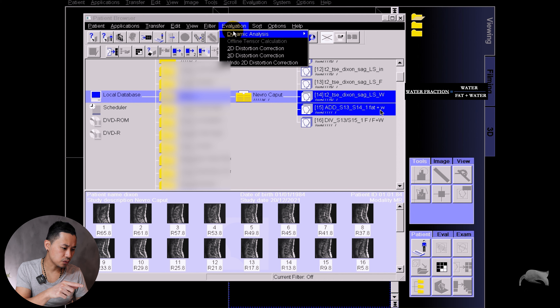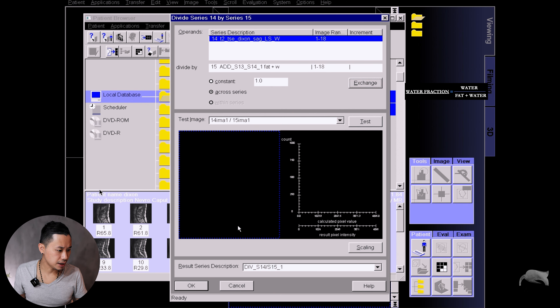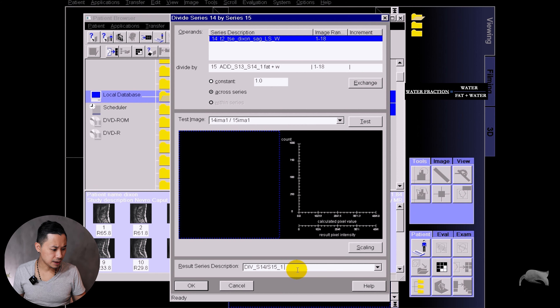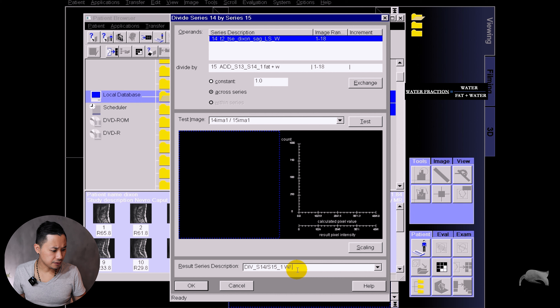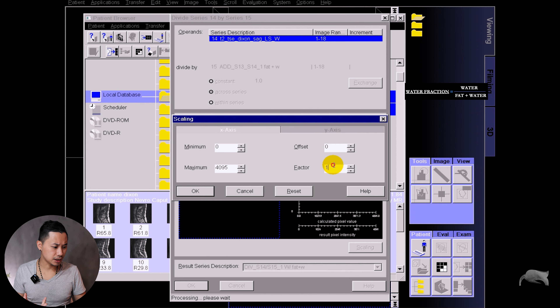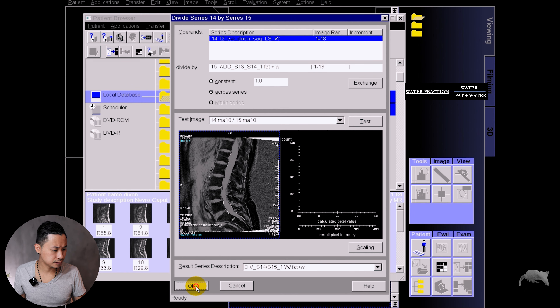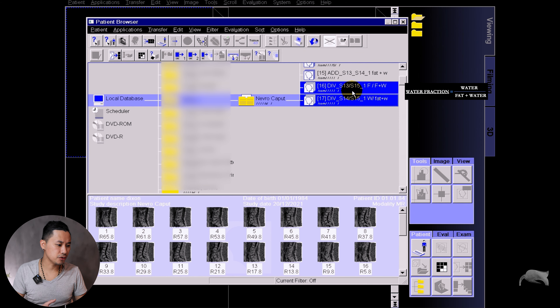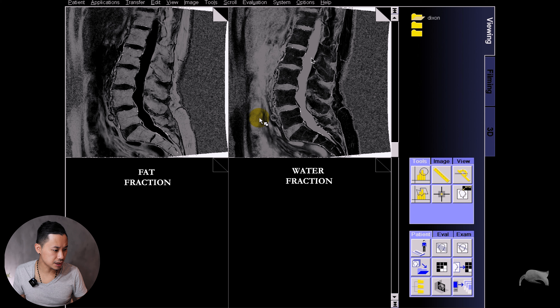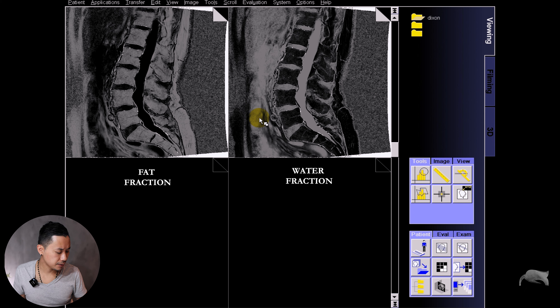Now we're going to do another step — getting the water quantification. The equation for this one is water divided by fat plus water. So what you're going to do is mark fat plus water and the water images, go to Dynamic Analysis, Divide, and then Exchange so the equation becomes water divided by fat plus water. Rename it 'water divided by fat plus water,' then go to Scaling, put 1000 there, and do a test to check — the images seem correct.